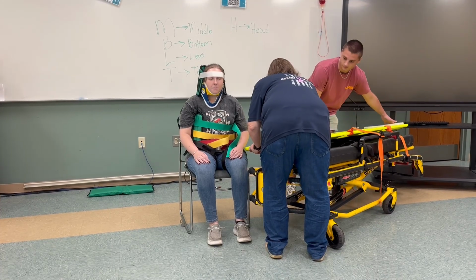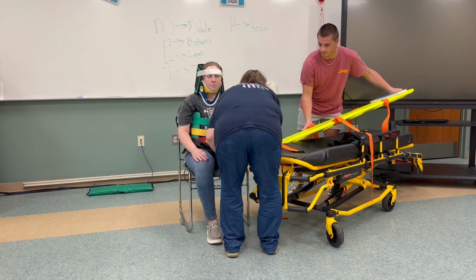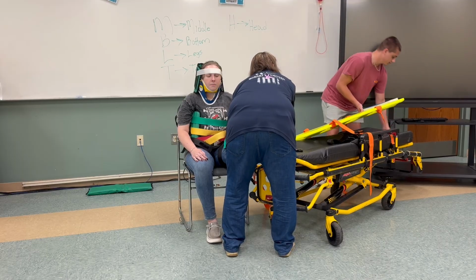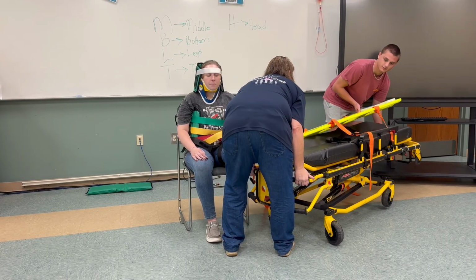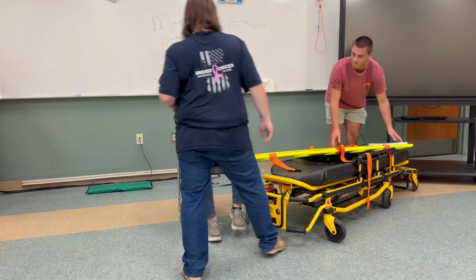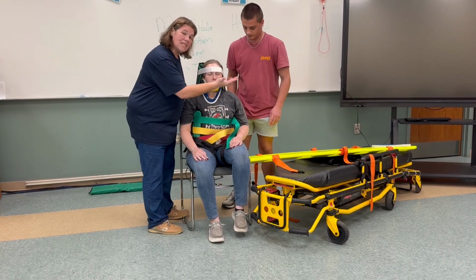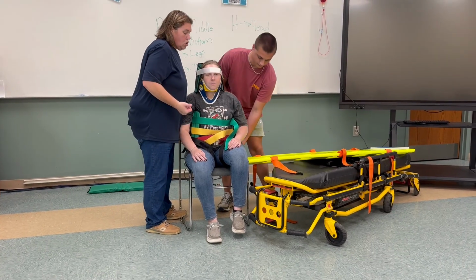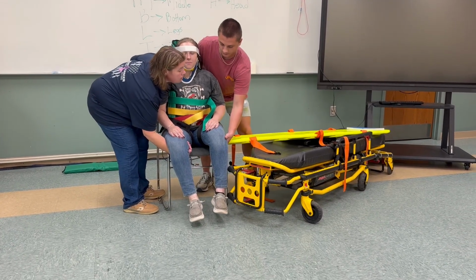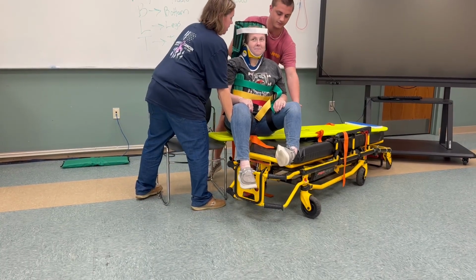You got that side? Okay. And we're going to go right underneath. All right. We can go down. I'm going to go down the structure just a little bit more. Ready? Ready. 1, 2, 3. All right. So, with this, we're going to place the patient on the backboard and we're going to slide her out. Ready? Let's go up over the chair or something. Okay. 1, 2, 3. All right, she's there.